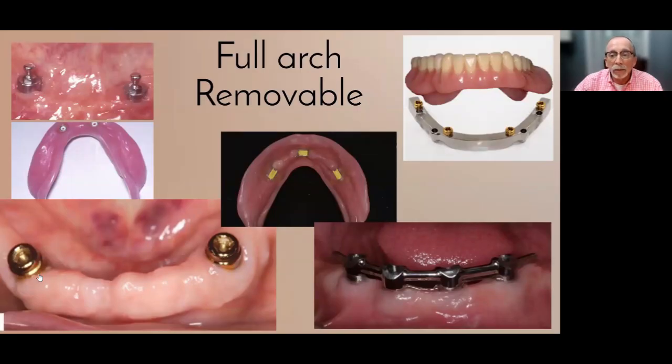And that is saying it is a tissue-borne appliance, but yet implant retained, implant supported. So implant retained, implant supported but yet tissue borne, meaning that the denture will move. And in various ones of these overdenture attachments, it'll move more or less, but it will move. And so that's not bad. That's just what it is.